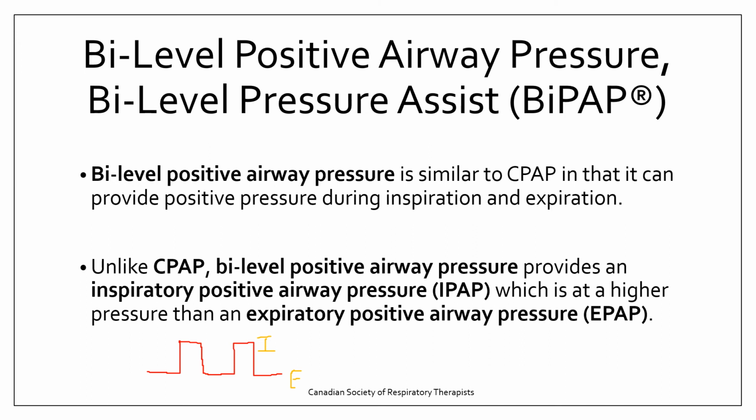So if you have a patient and you're trying to remove more CO2, we want that to be a little bit larger, a little bit bigger, and if we're changing our baseline pressure and it's not going to change and it ends up changing our level of support, then that may be detrimental to the patient.